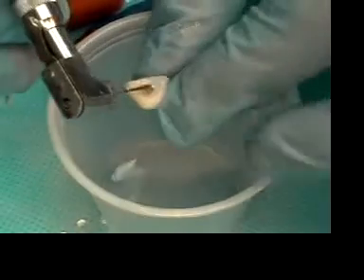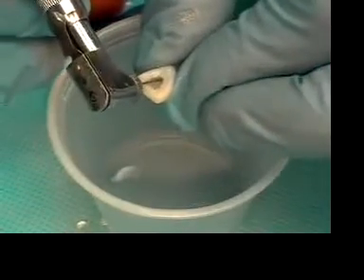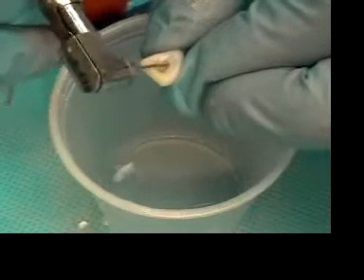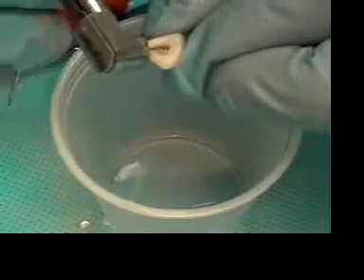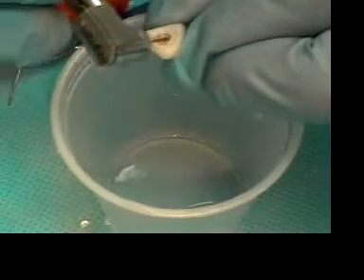Okay, I'm next going to use the number four gates glidden. Again, I'm just using the four gates in the coronal portion of the preparation.